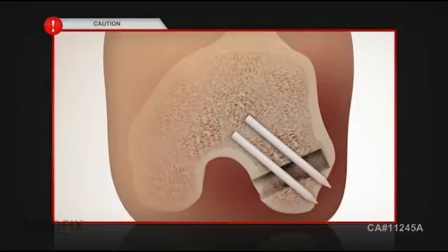CAUTION: After adjusting, if the laser line is not visible on the bone gauge pin, then implant protrusion will occur. Therefore, an alternate device must be used for femoral fixation.